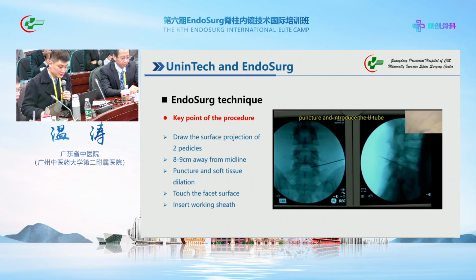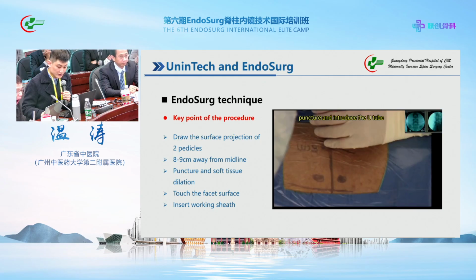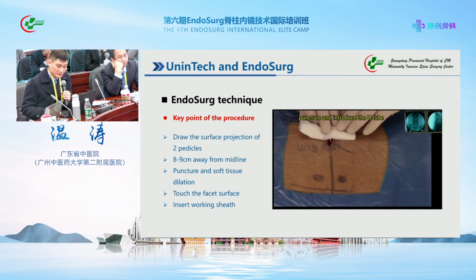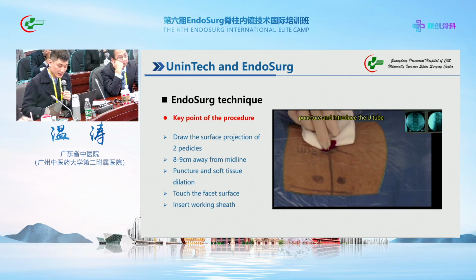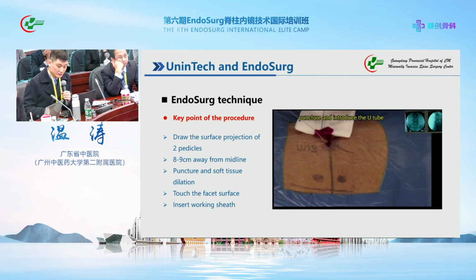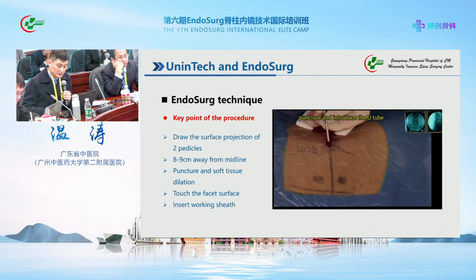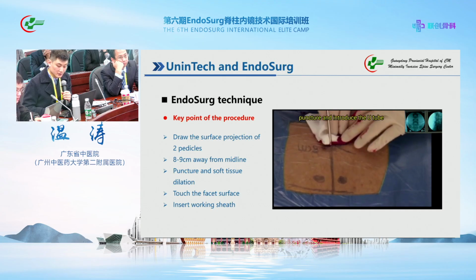Projection of the two pedicles. Mostly it is 8 to 9 cm away from the midline, and then the puncture and soft tissue dilation. First, we use a needle to touch the surface of the SAP, and then we insert the working sheath.